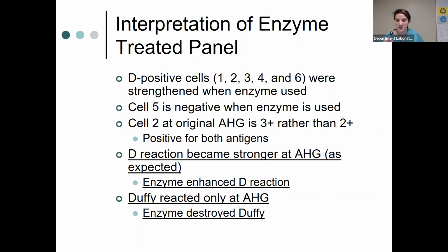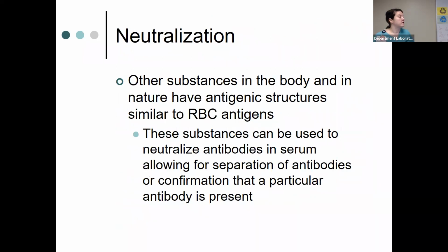And this just kind of describes what we talked about, interpretation of that enzyme-treated panel, that example. All right, so that's enzyme. I want you guys to not confuse enzyme treatment with neutralization. Enzyme treatment, let me say this one more time, you are treating your commercial red cells, okay? Neutralization, you are treating patient plasma to absorb out that antibody, right?